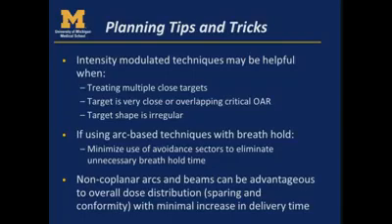If you are using an arc-based technique with a breath hold, be sure to minimize the use of avoidance sectors in your VMAT planning, because it can cause the patient to hold their breath when you're not treating. The therapist can't necessarily tell when that beam is going to turn back on, so it's better to have no motion at that point in the delivery.